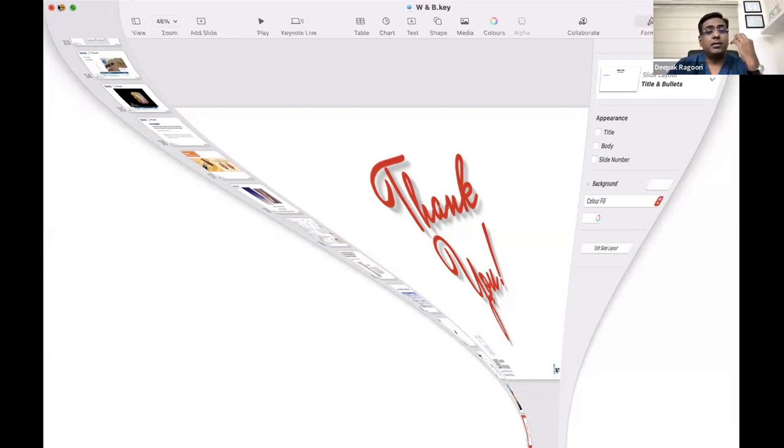That is when the disengaging capacity of the basket becomes very, very important. If it means that you have to test it by picking up the stone and dropping it, do it in the pelvic calyx system itself, so that you're not in soup once you get into the ureter. For that reason, I was stressing so much about the tip volume of a basket. You shouldn't have a big basket and get too excited that you can grab the entire volume. There is no fun in grabbing the entire volume when you don't have access to come out. So be careful when you pick up the volume of a stone, and also doubly make sure that the disengaging capacity of the basket is good.